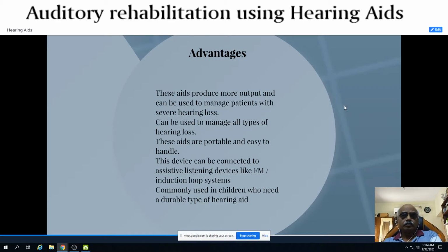Currently all the classrooms in deaf and dumb schools are provided with FM devices wherein the teacher's class will be broadcast using frequency modulated signals, and these signals can be picked up by the behind the ear model hearing aid and amplified. So the students who attend class in their special schools using behind the ear model hearing aids will be able to listen to their teacher as a normal child would, because the teacher is broadcasting his entire words via frequency modulated signals, and these signals can be picked up and amplified by the hearing aid.